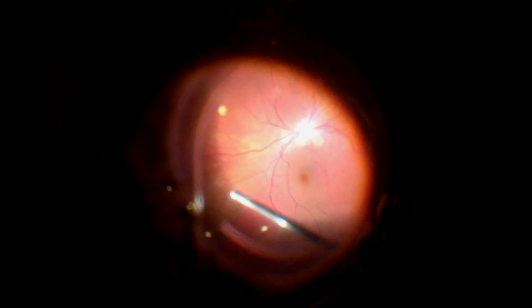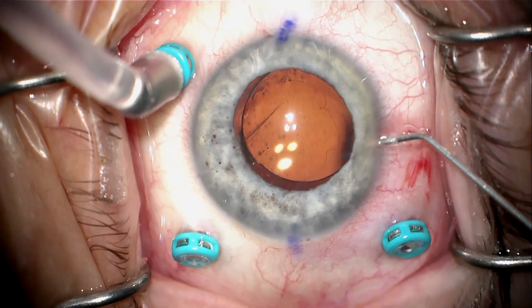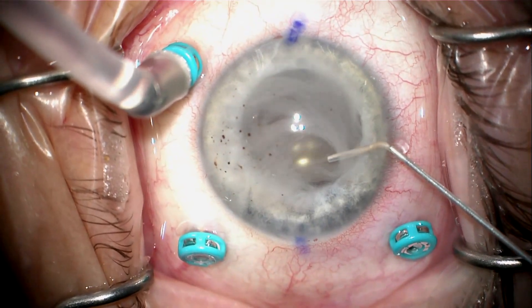Now we're going back using the posterior visualization and completing the vitrectomy, removing all of this vitreous that has inflammatory debris left over in it. This will also release the vitreous traction we showed earlier at 6 o'clock, wrapping around the inferior haptic.